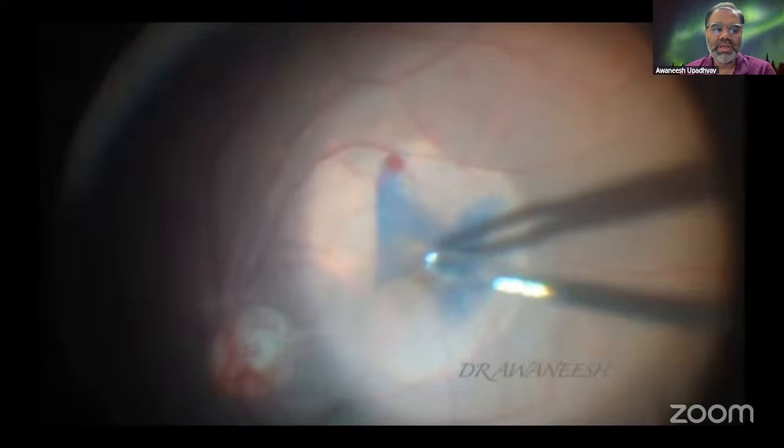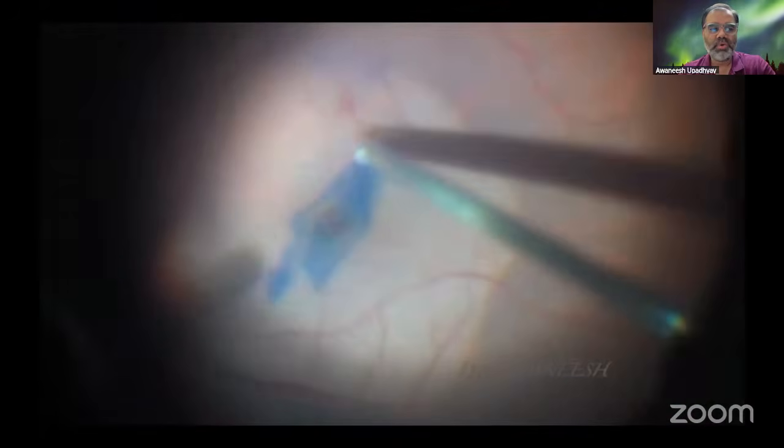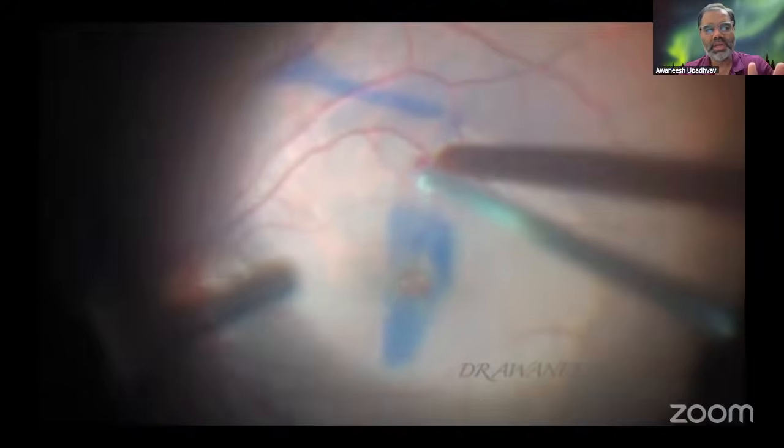I usually do it in the intertemporal arcade, use the pinch and peel technique, almost 1 disc diameter away from the fovea. I prefer multi-layered flaps, and I tend to make around 4 to 5 flaps, as what Dr. Vidhi was talking about. Then I complete the peripheral ILM peeling up to the arcade.